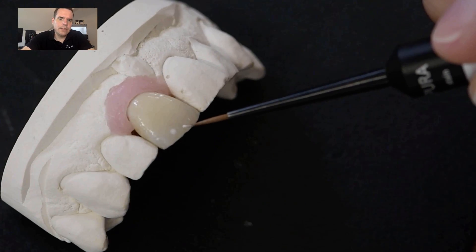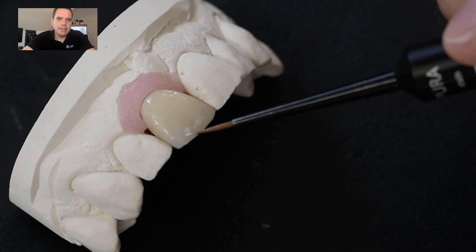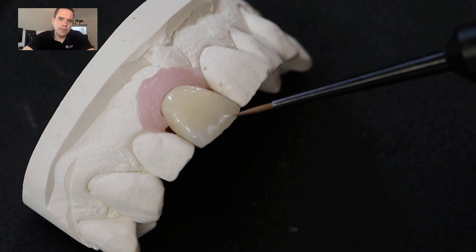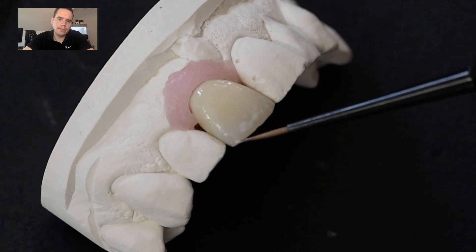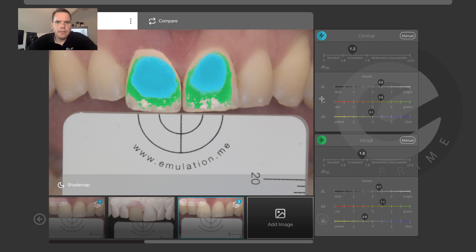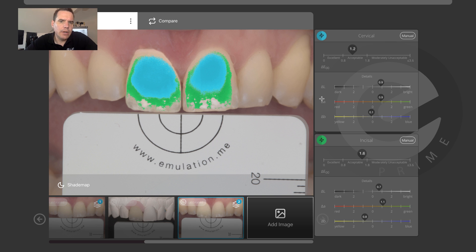The last thing we have to do is characterize that incisal area to copy the fluorosis with a bit of white myostains before we take a photo. And then this is already the second digital try-in and the result after a bit of characterization, also a little bit of shaping. The incisal aspect has improved as far as the delta E is concerned, and that's now ready to be completed and sent out to the dental office.